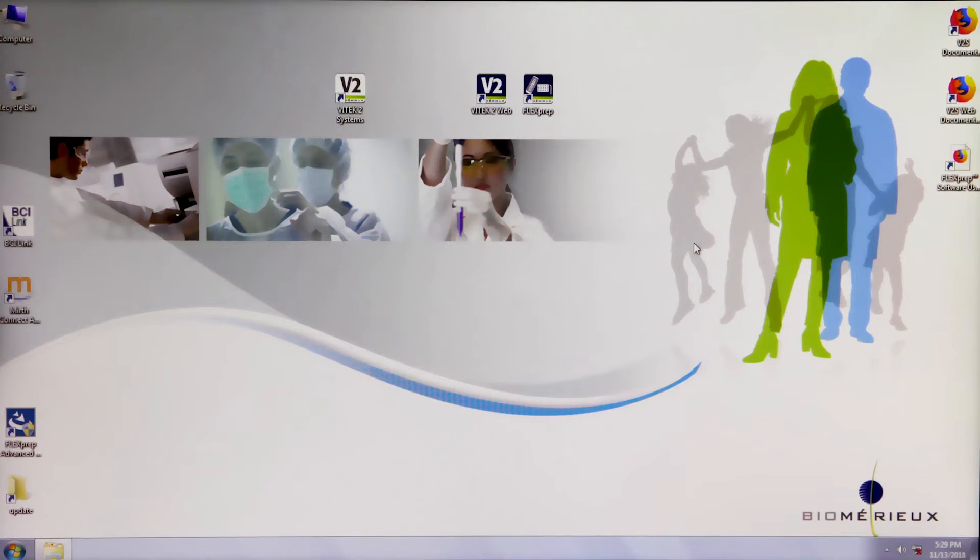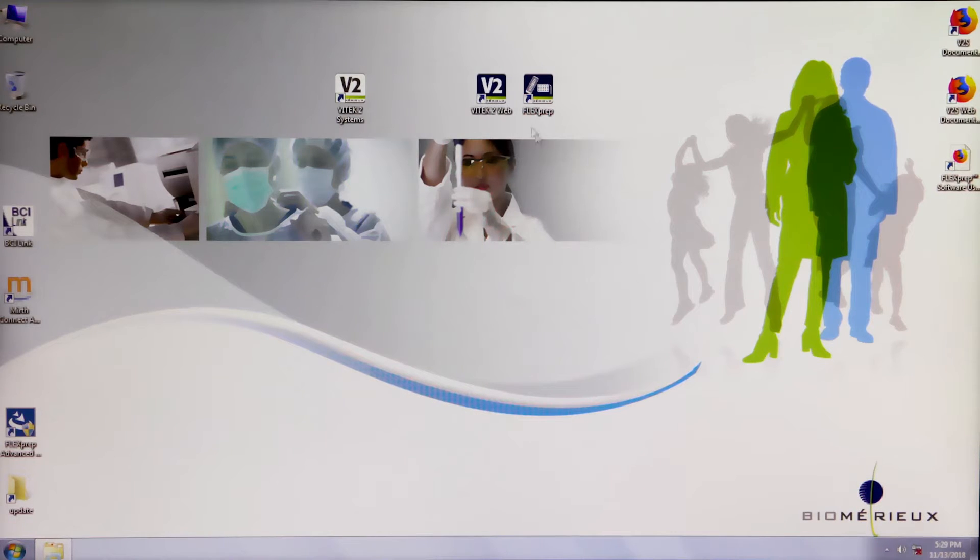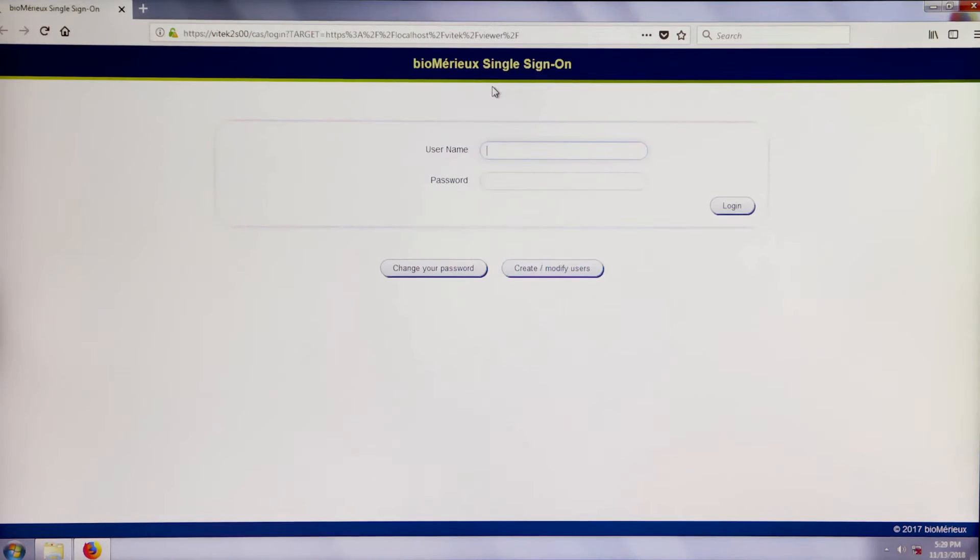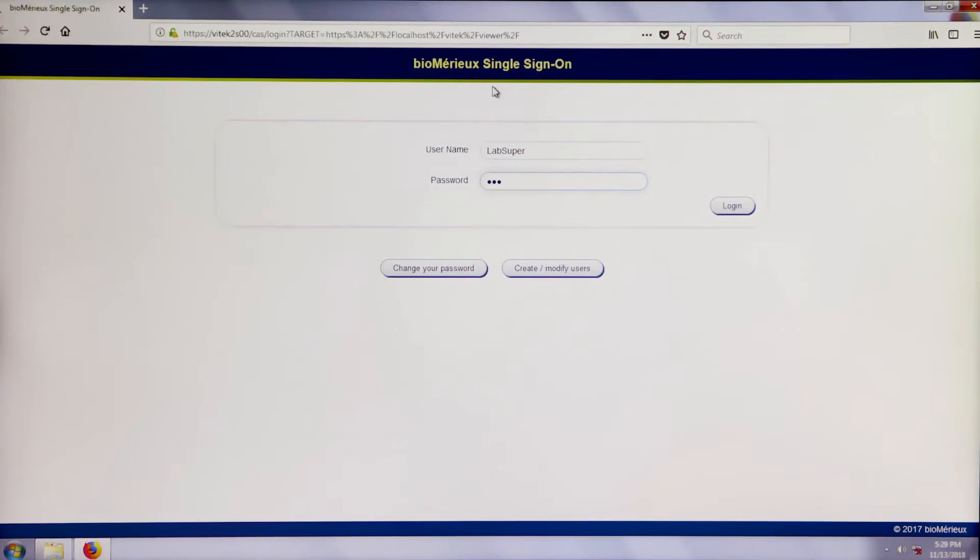To add a new AST card type to the Vitek2 system software, perform these steps. Log into the Vitek2 web application by double-clicking the Vitek2 web icon on the computer desktop.